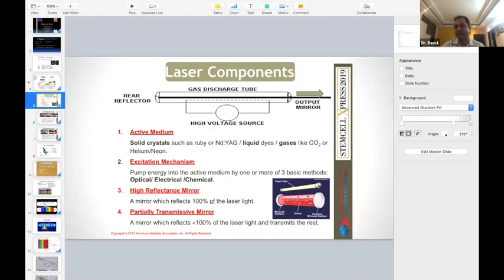It's a very simple thing. So they will release an energy. When they release the photons, they have to strike somewhere. So in this tube, we have one side a complete reflector. The photon will go and strike the reflector and come back again. And there is only one output, what we call a partial reflector, from where the laser will go out. And we can actually select what sort of laser can go out.